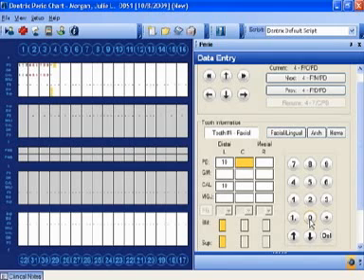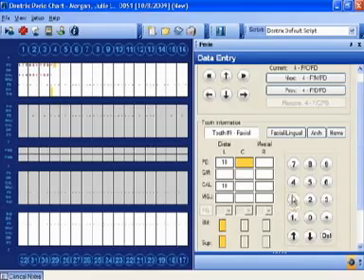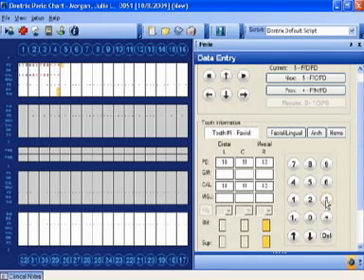If you've got an 11, you're going to mouse over with your toe to the 1 dot, rock back on your heel, and then add the 1 for 11. If it's a 13, same thing, you're going to do the 1 dot and you're going to add the 3 is going to be the 13. So you're just mousing over and heel clicking. Those high numbers are rare, but at least you're able to do it.